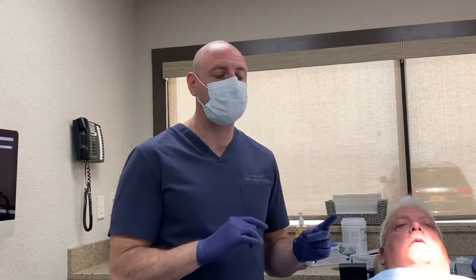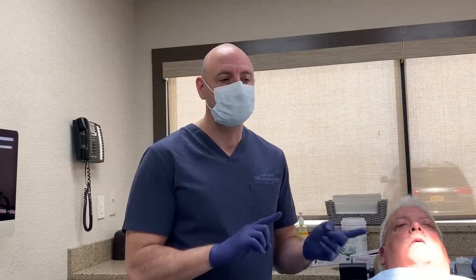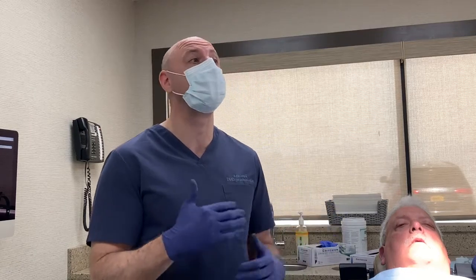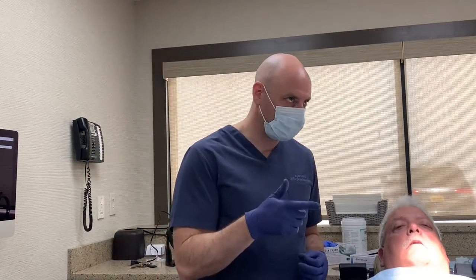Other times, and it happens rarely, the framework of the prosthesis can distort. Sometimes when you take out some of these fixed restorations, you have a challenge getting it back in because things have shifted and distorted. And there is nothing in the literature, at least that I've read even recently, recommending that the longevity of the prosthesis will increase or be more predictable if you remove it for hygiene. It is nice to remove for hygiene, and it's easier for everybody if you can do it, but think about the pros and cons, because if you take it out, you should replace the screws, and it's going to require time on the clinician's side. It feels good, tight, should be no issue. I don't need to expose the patient to additional radiation.